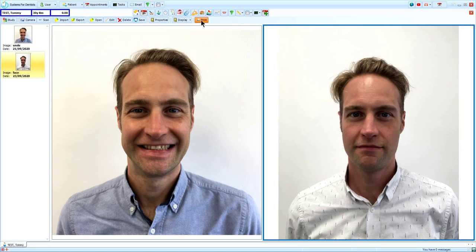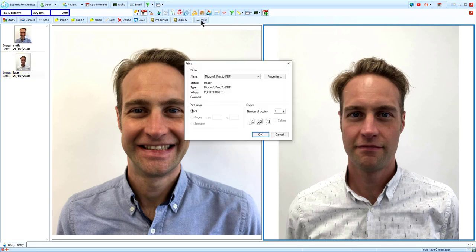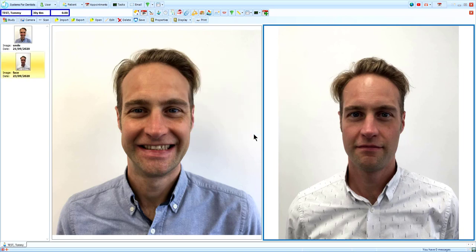Finally, Print will send this layout of images to the printer so that you can provide a copy for your patient or your records.